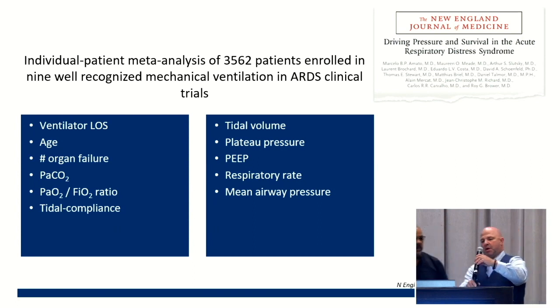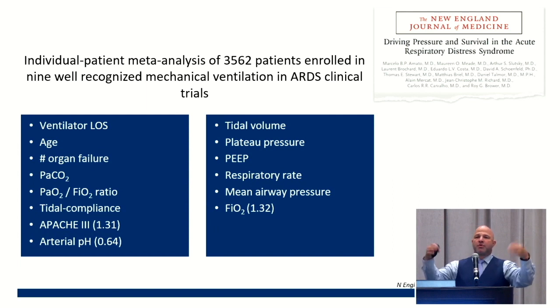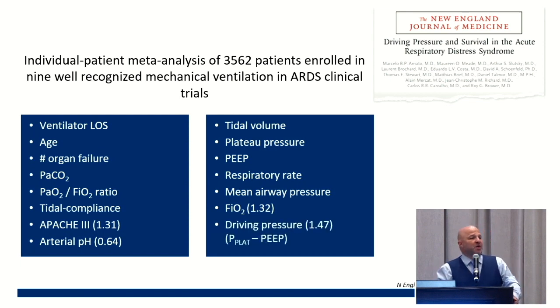Yep, I am good. So they sought to really answer that question: what is it and how do we hurt this lung? They went line by line and did a retrospective analysis of each one of these parameters to answer the question, is this most closely associated with mortality, or is it associated at all? What they came out with is something called the driving pressure, which is the difference between your plateau and your PEEP, that is how you get it, and it is the most closely associated ventilator parameter with mortality.